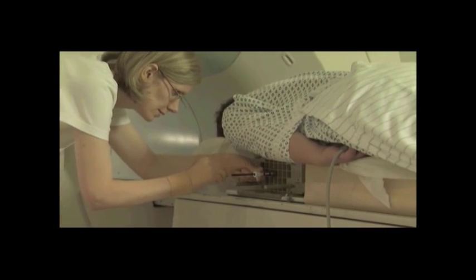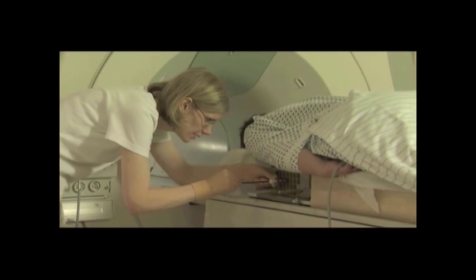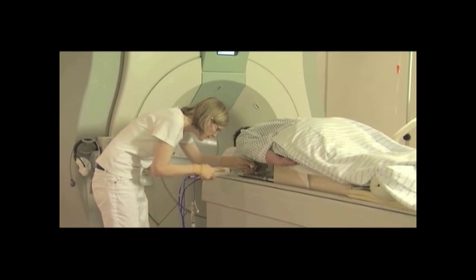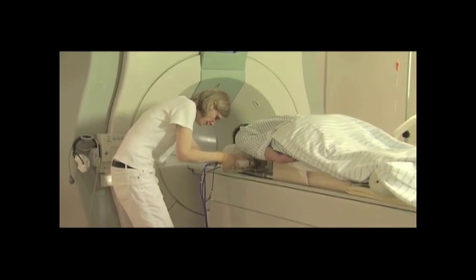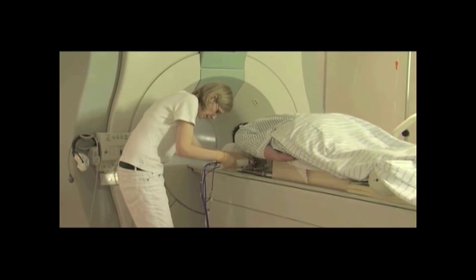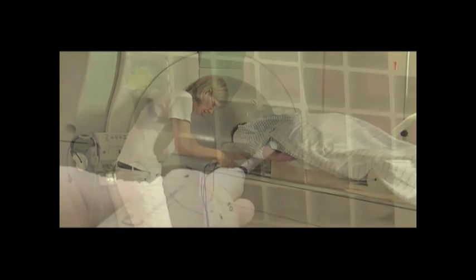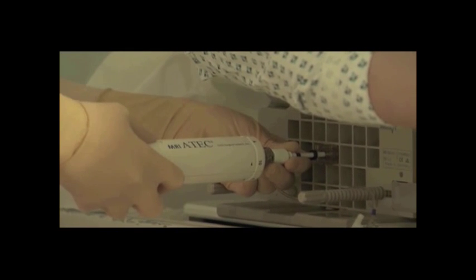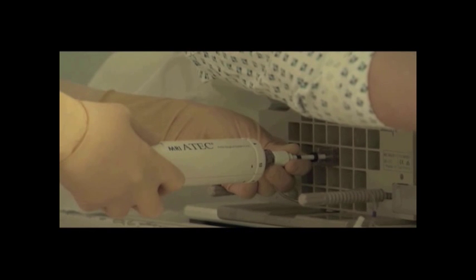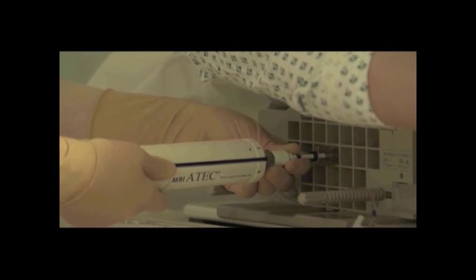Remove the localizing obturator from the introducer sheath. Place the Atec MRI handpiece into the introducer sheath on the desired starting clock position indicated by the numbers on the handpiece. The flat portion of the handpiece correlates to the cutting aperture. With this surface facing up, your needle will be at the 12 o'clock position. Core samples can be taken at any clock position depending on the location of the area of interest.